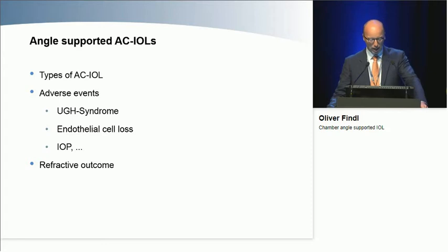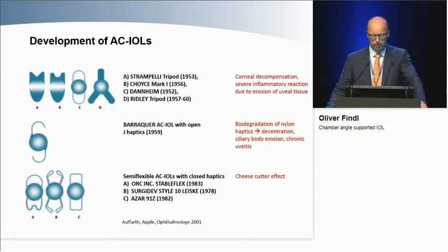But I want to talk about the types of AC IOLs, essentially the history of AC IOLs, because that's relevant, because many of the lenses we're explanting today are actually quite old AC IOLs. Then about the adverse events, and also about refractive outcome, just briefly at the end.